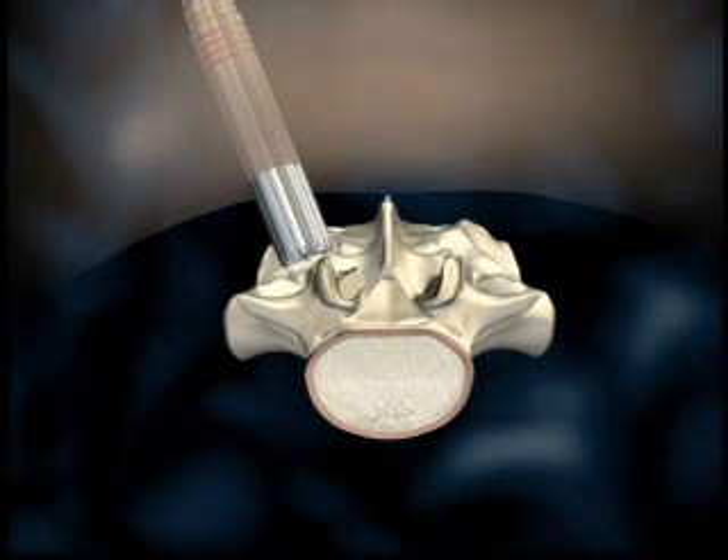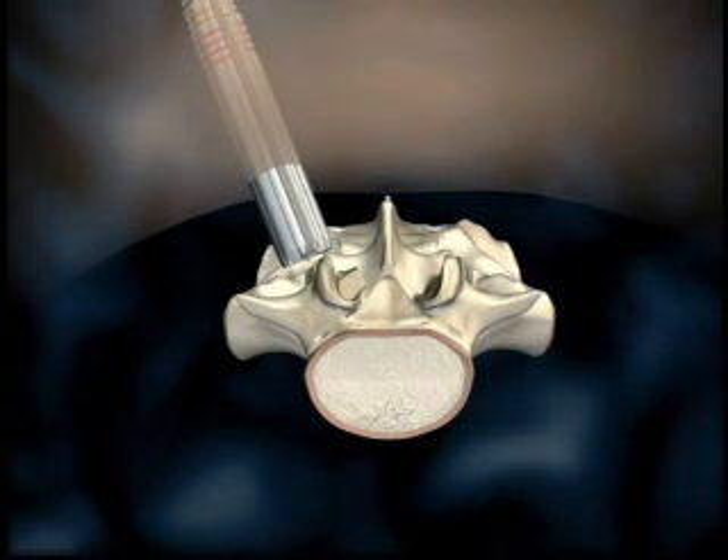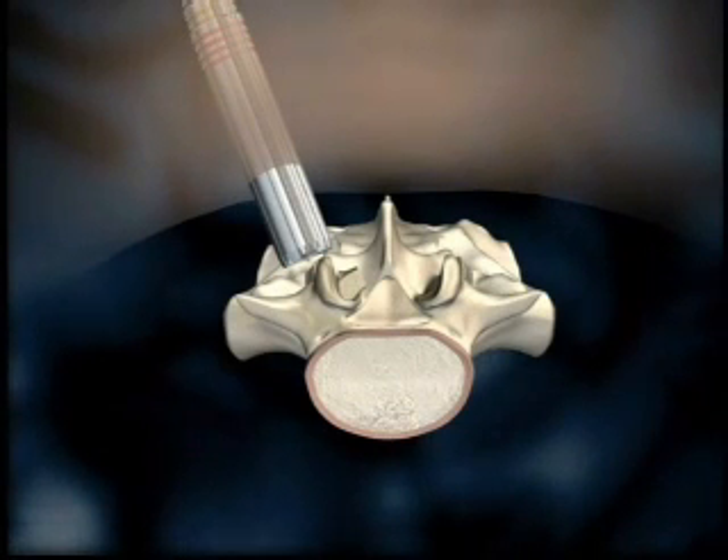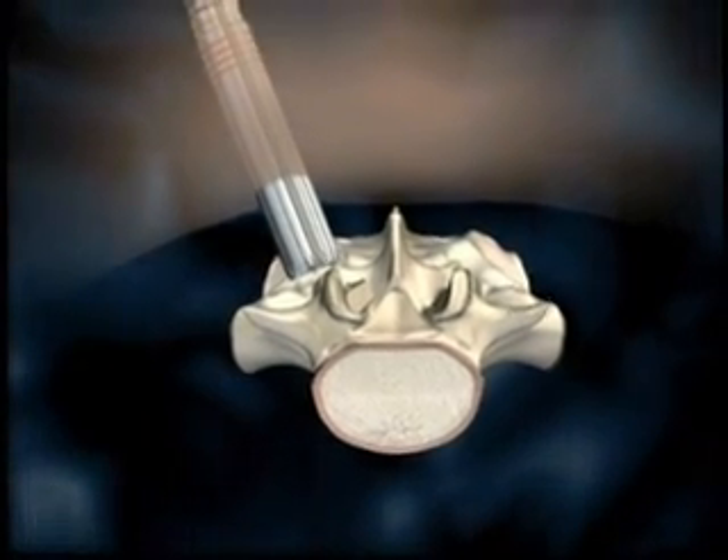Following removal of the guide wire, dilators two through nine may be used to open the space. The appropriate length metric tubular retractor is placed over the dilators, and the dilators are removed.